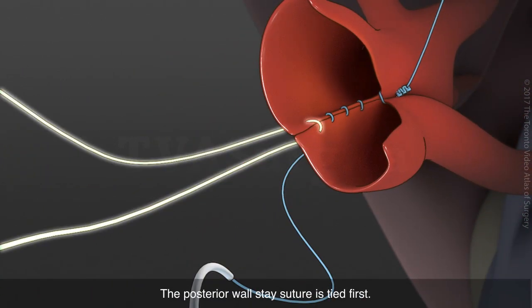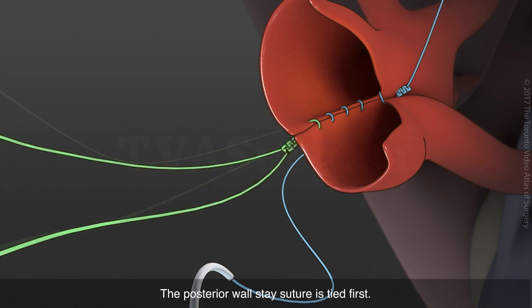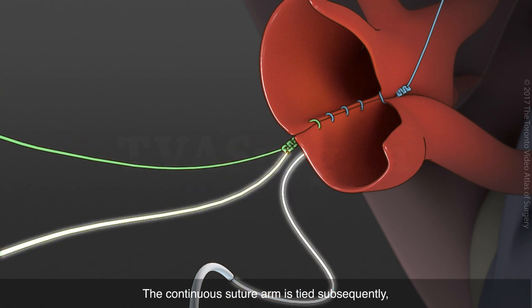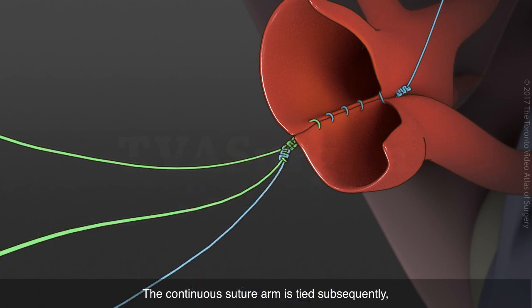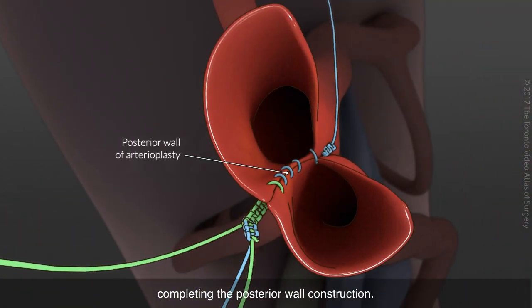The posterior wall stay suture is tied first. The continuous suture arm is tied subsequently, completing the posterior wall construction.